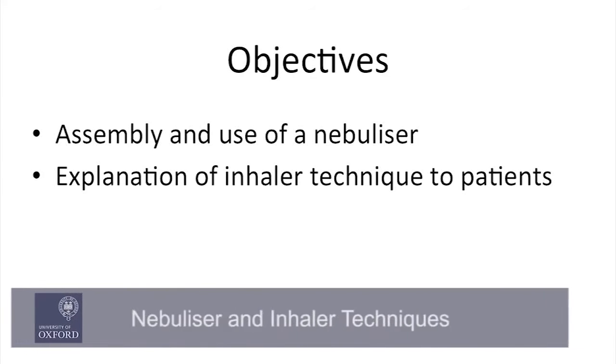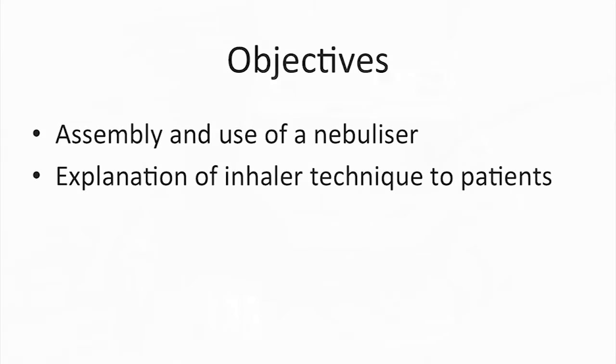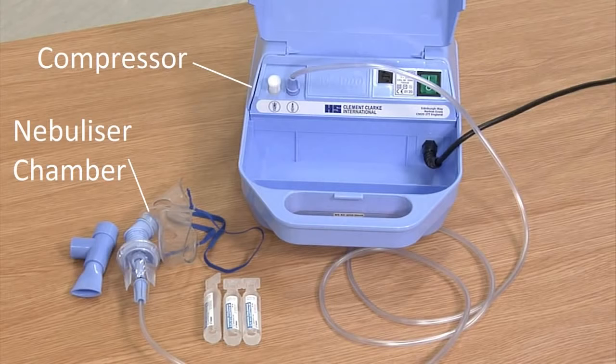This video will show how to correctly assemble and use a nebuliser to deliver saline or drugs. It will then show an example of a consultation in which inhaler technique is explained to a patient. This is a typical nebuliser which might be found on the wards.